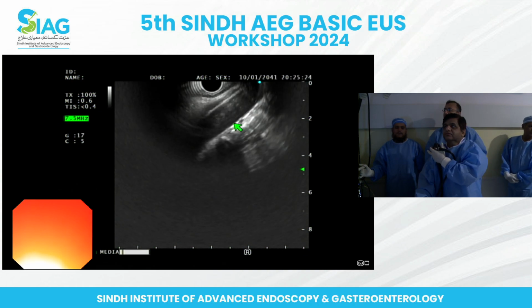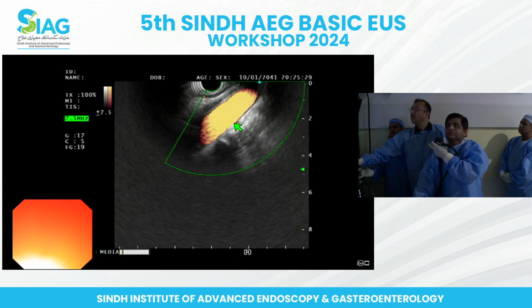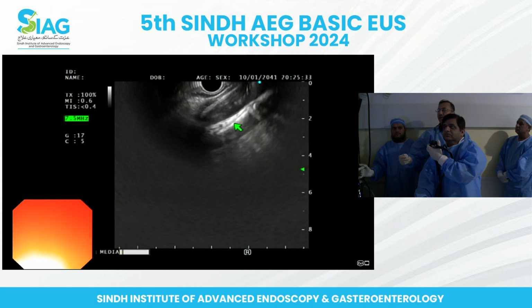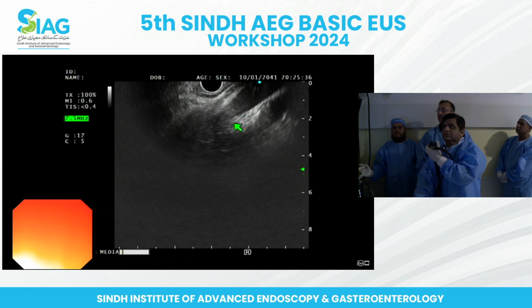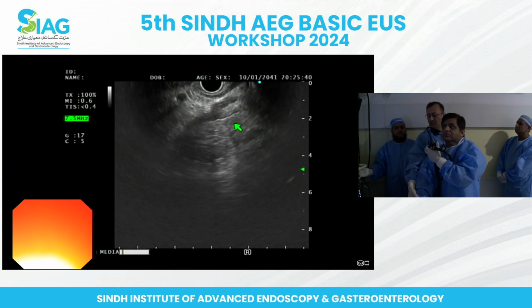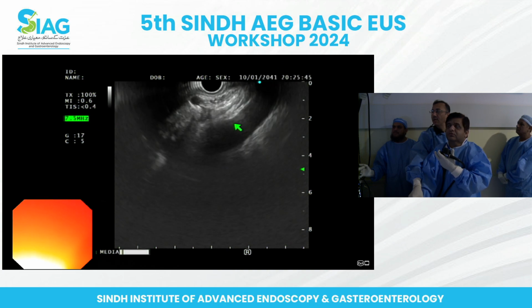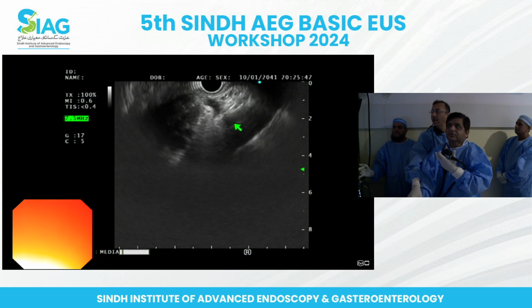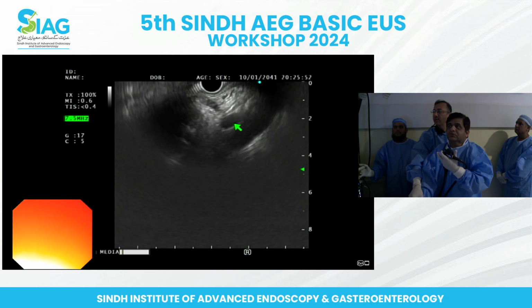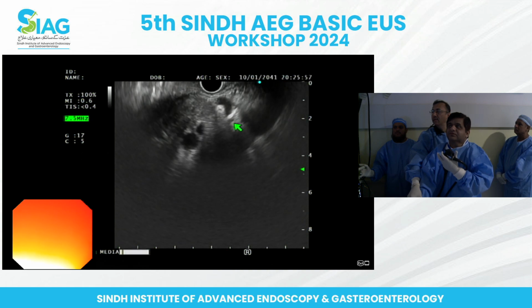Okay. Now here you have the aorta. You want to confirm the aorta? Just put in the flow, right? This is the aorta. It's a big vessel. Now slide along the aorta, go down. You're going to see the first takeoff of the vessel. All the time, just a little jiggling movement like this, and you keep the aorta under your vision, and slight push, and there you have the celiac artery right underneath your transducer, and this is getting divided into common hepatic and splenic artery.